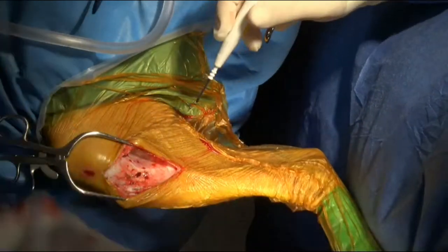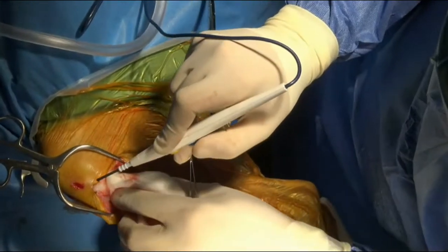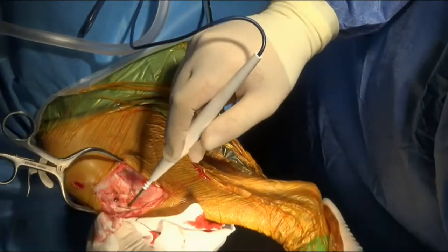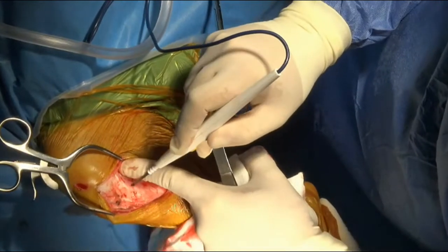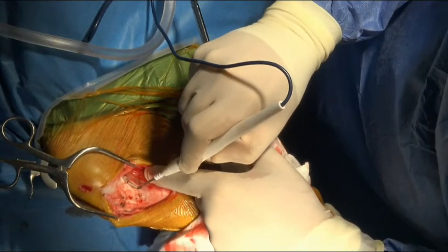And so now we can see the medial tibia. Do you want to hold on to that, Ian? Control this little bleeder here. So you've just got the proximal medial aspect of the tibia. We've got the medial collateral ligament running down here. I'm just going to take the popliteus muscle off that a little bit.